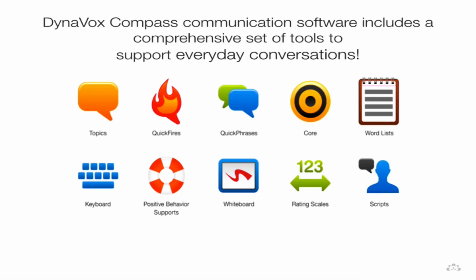With each of the page sets, you get a combination of these communication tools. So we've already seen when we looked at the Navbar that we had topics, we had access to quick fires and quick phrases, we had access to the core vocabulary and word lists, we also had access to the keyboard, positive behaviour supports and the whiteboard. Some of those other tools we'll see in some other page sets, but you certainly see combinations of them and just different ways that you might access those different tools to support conversations.